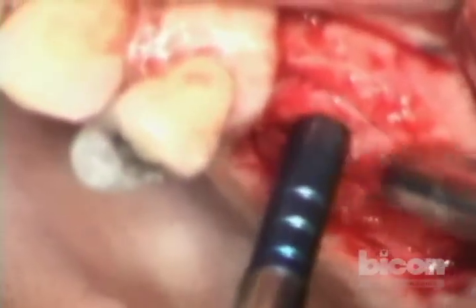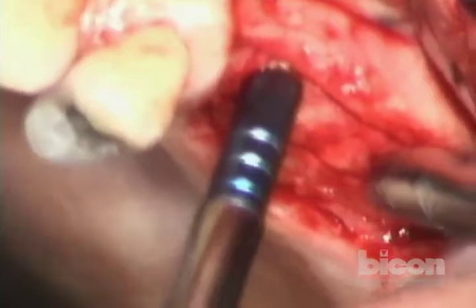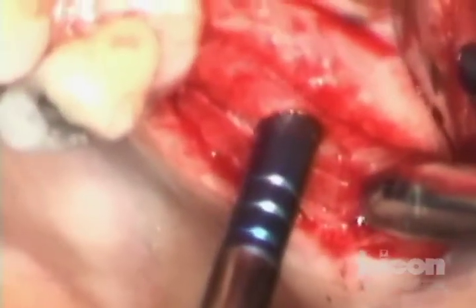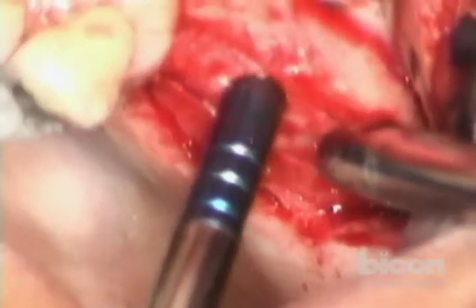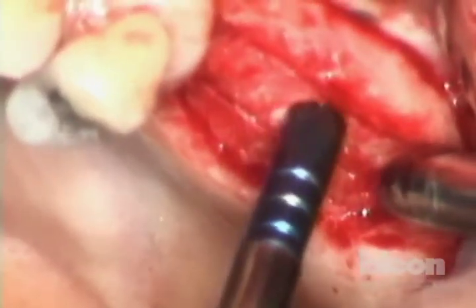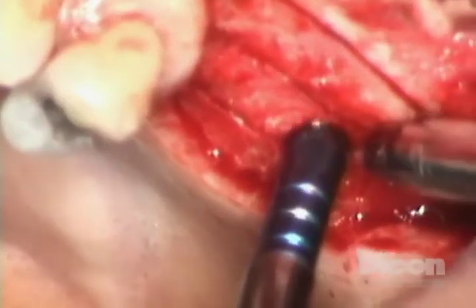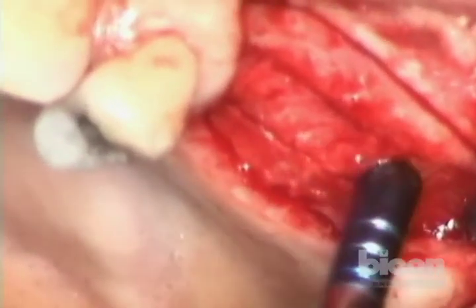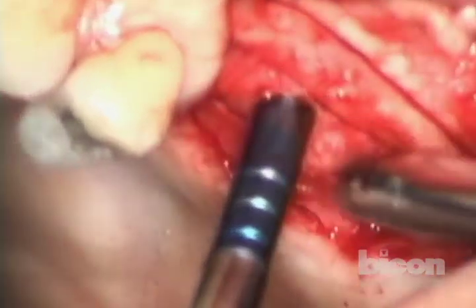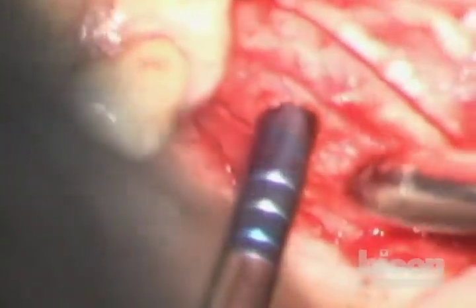The name of the game here, as I repeat usually, is patience. This is the time where you really have to exert all the patience that you were given, and then some. Because what we're doing is: we scored that bone, and now we're going to fracture it and carry the membrane up with it. This part — our patient did not like the last time and felt a little syncopal — so we preempted this time and sedated her.